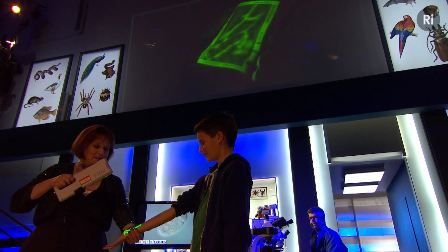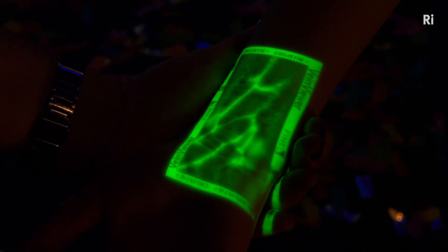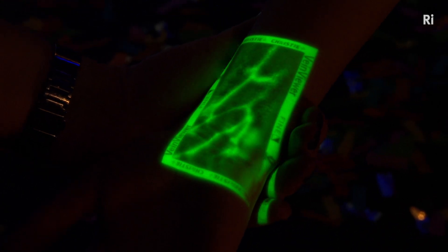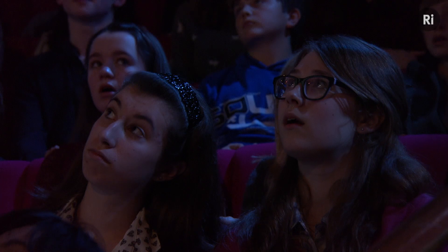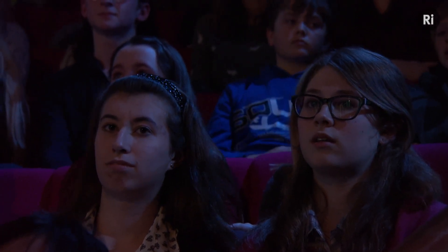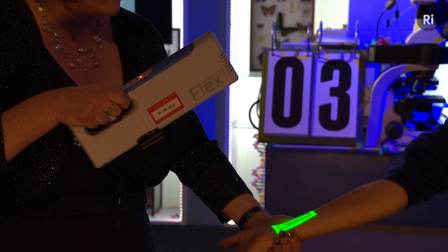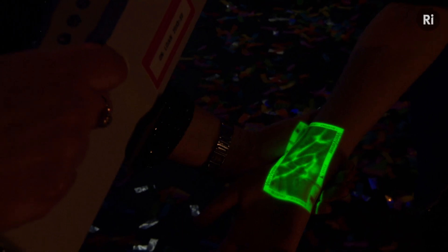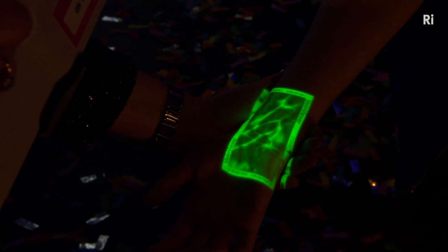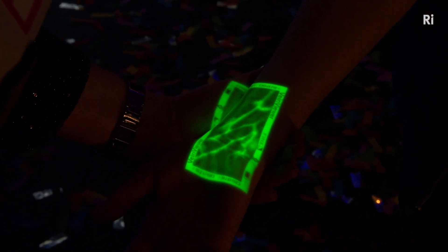Can you see that? So this is the blood inside Ollie's veins. This is an incredibly useful machine, because when people are learning to take blood in hospitals, they can use this to see exactly where a patient's veins are without poking them around with a needle. This is a really, really clever machine. And what we're looking at here is this haemoglobin protein that's rushing around inside Ollie's veins.